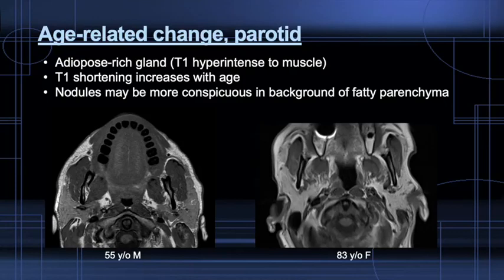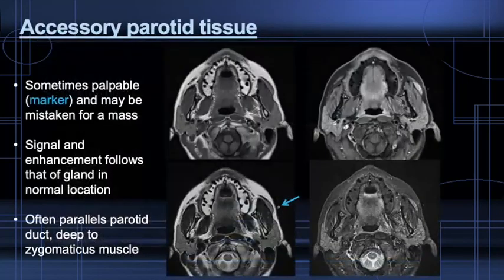The parotid undergoes fatty involution with age, and it's a good reminder to always include pre-contrast T1 imaging on face MRI protocols, as pathology may be more conspicuous in a background of brighter fat signal. This case was sent for a palpable facial mass. MRI simply points out accessory parotid tissue of normal signal, identical to the remaining parotid tissue — asymmetric, yes, but not pathologic.